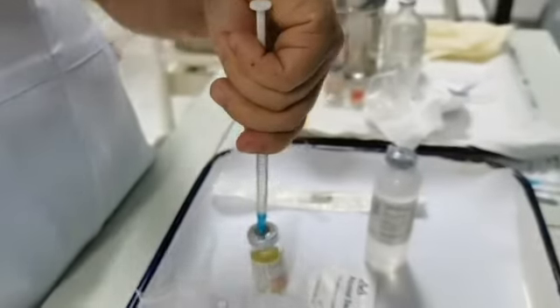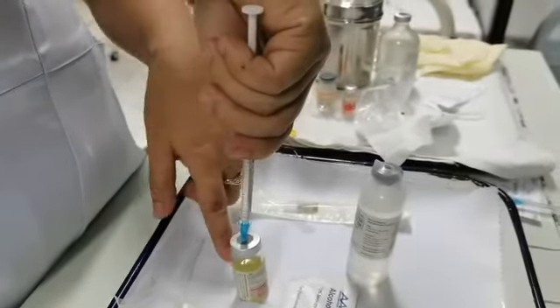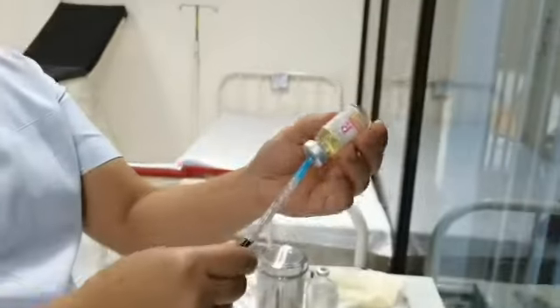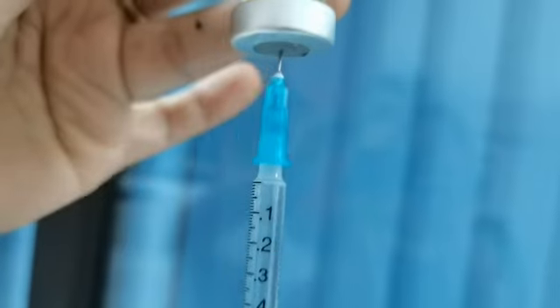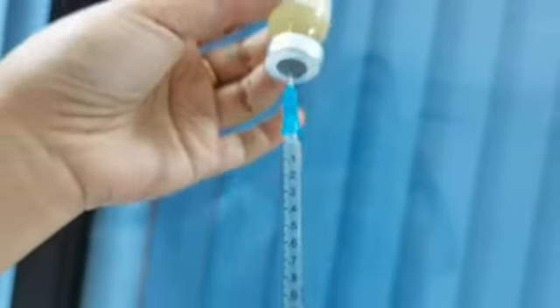Do not move the plunger down because you are introducing the medication inside the vial. So just hold the plunger and invert and get 0.1 ml of antibiotic. So since it's already 0.9, you just move the plunger down. Okay. So 0.1. A total of 1 ml.